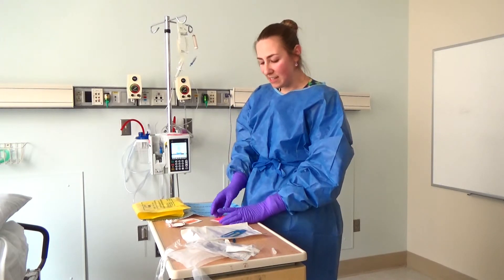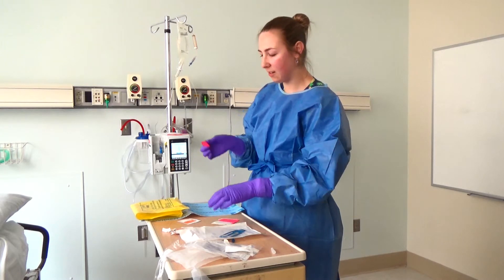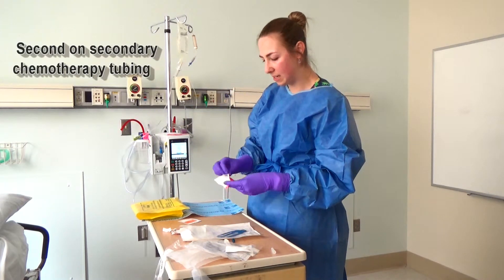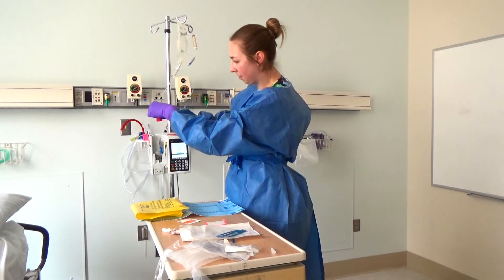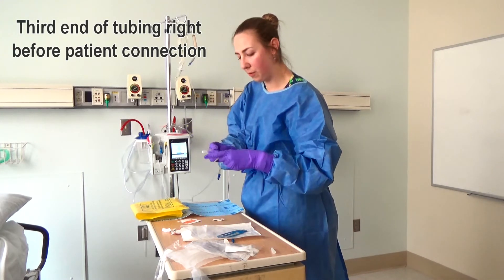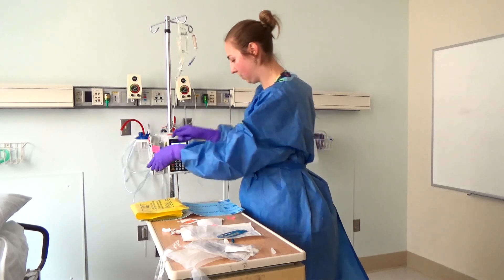At this point, it's always a good idea to put your stickers — you can do that now or at the end. Personally, I forget if I don't do it now. I'll put one sticker on the primary line just above the pump to indicate that this is chemotherapy, a second sticker on my secondary chemotherapy tubing just above the pump, and the third sticker goes right at the end of the tubing, right before the patient connection. Then we're good to go.